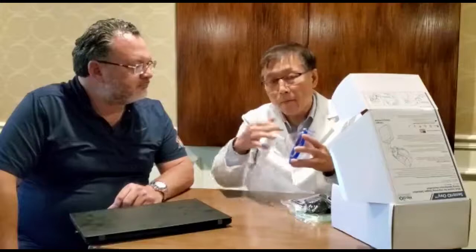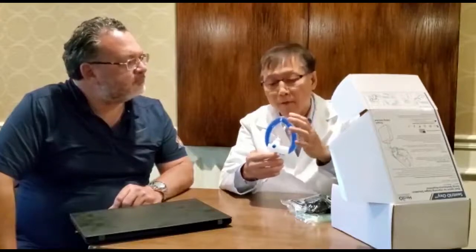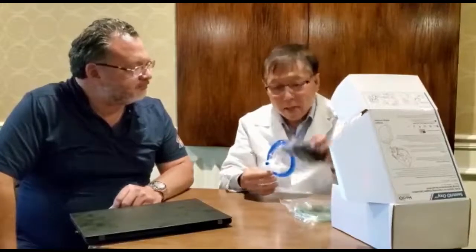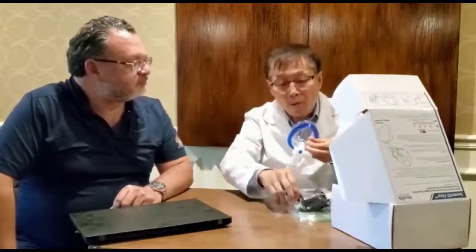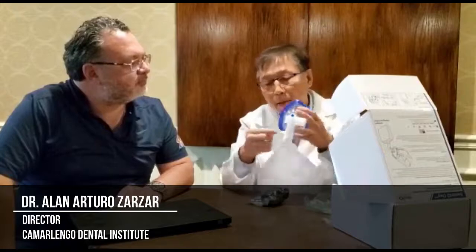You simply attach the mask to the manifold, and you will find that there's an inflation valve to reinflate the cushion if it were underinflated. But you will put this right over your face. It comes with a head strap that is attached to this. I won't put it on now, but you basically put the strap on and you wear it over your head, and there's oxygen tubing. You connect the two ends, and it's all explained in the user's manual.